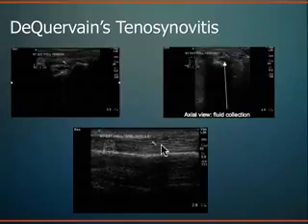And then this is an ideal depiction, but basically you're imaging the tendon. You can see the tendon sheath, and then you can see your needle slip into that tendon sheath and see infiltration of the fluid around the tendon itself. Also nice to ensure that you're not actually in the tendon. Intratendinous injections are contraindicated, especially if you're talking about cortisone. Certain modalities you're actually trying to target the tendon itself, but in general, you're trying to get that medicine around the tendon, but not actually in the tendon. And you can see that quite nicely when you're using ultrasound guidance. It can be quite helpful.